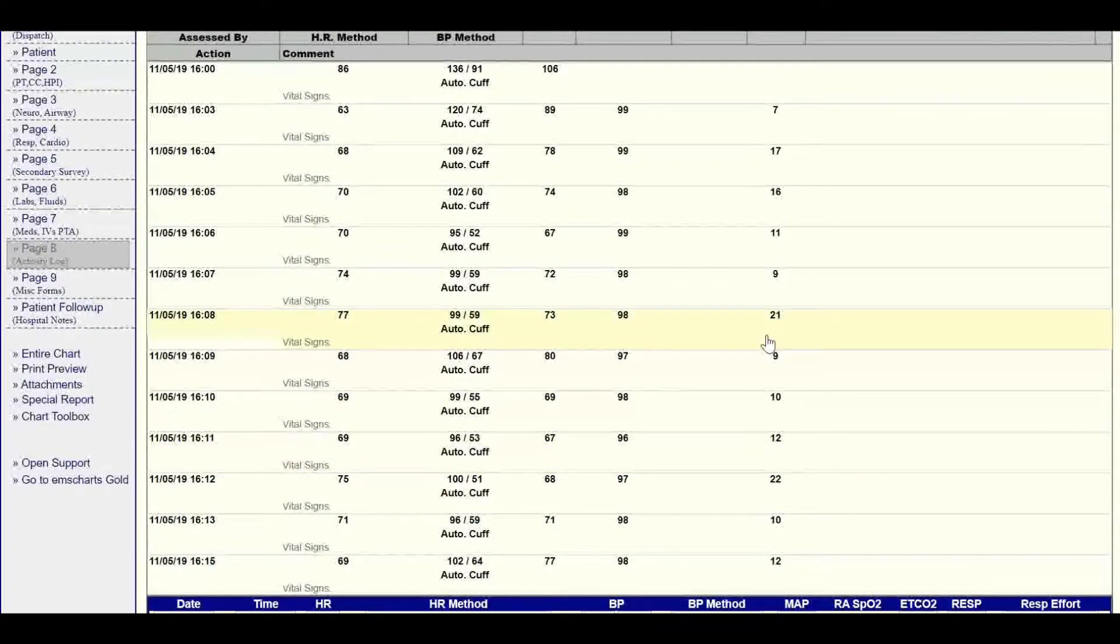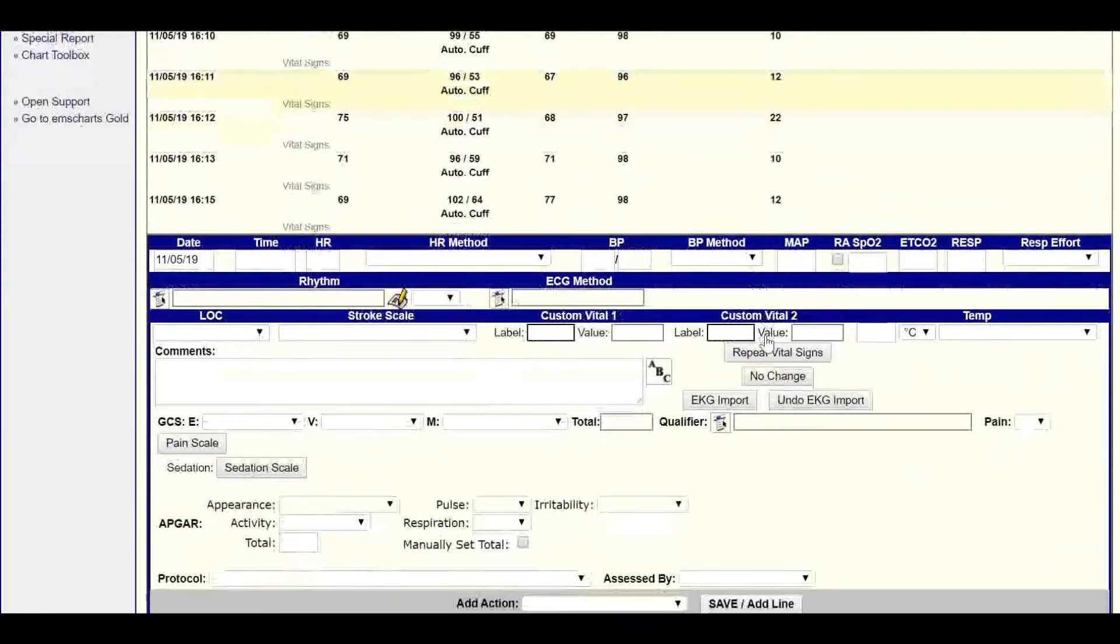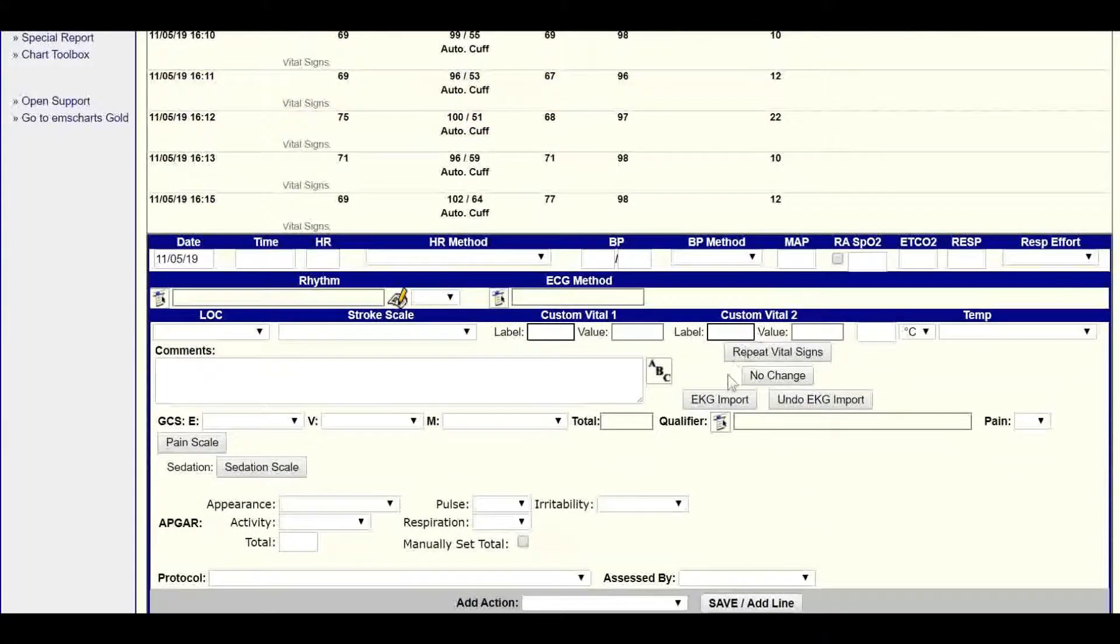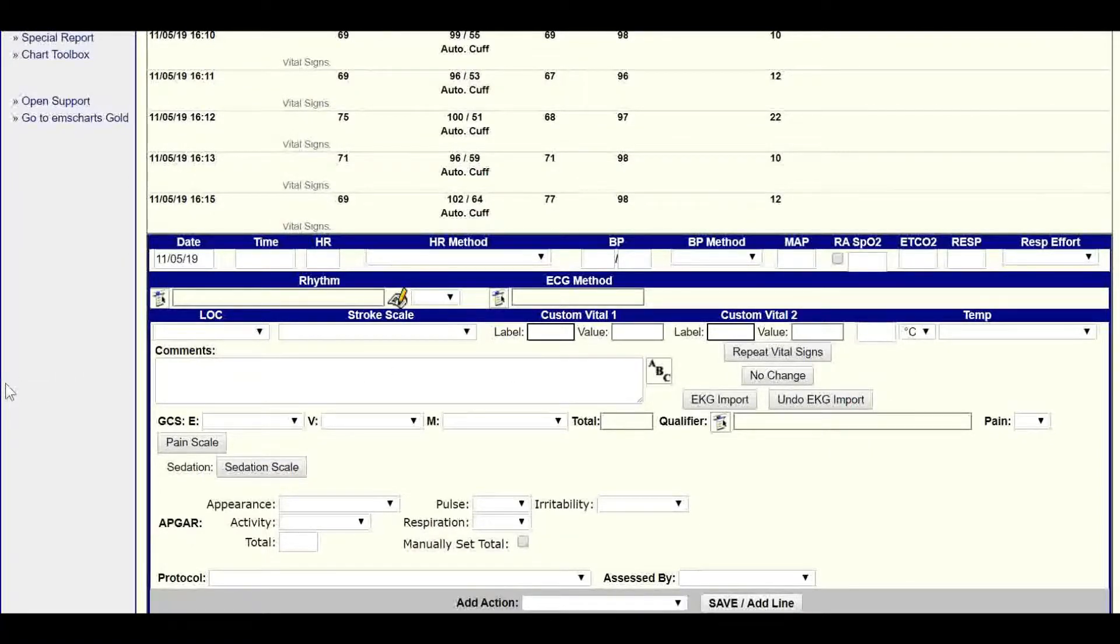If you happen to import the wrong file, there's no problem. You can just go down to the Undo EKG Import button, and it'll remove everything you've done.